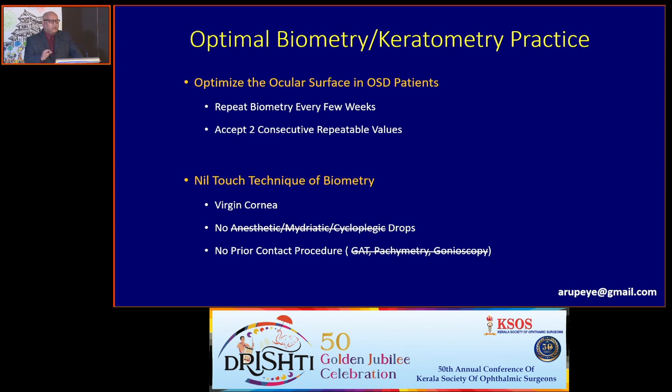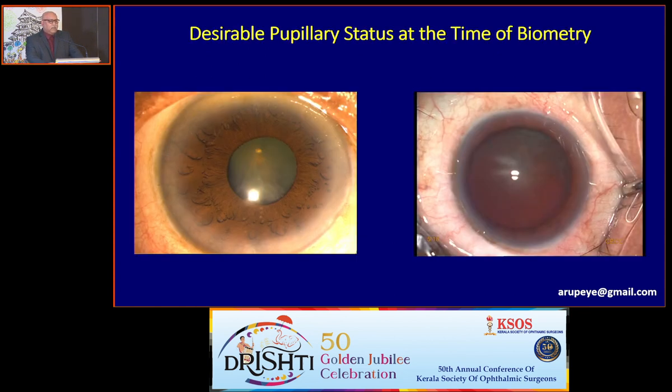Sometimes we end up doing it because of logistic reasons, but in such cases, it has to be explained to the patient that we could miss the target refraction. And it is always important to bring the patient back on another day for the biometric workup. Many a time, right from my postgraduate days, I have realized that you need to dilate certain eyes for a better biometry. I'm talking about ultrasonic biometry, and this also holds true for optical biometry.